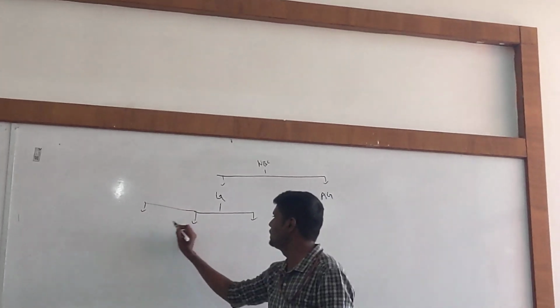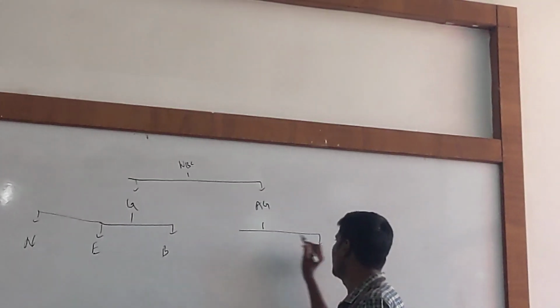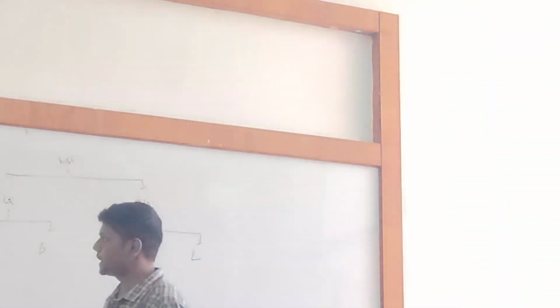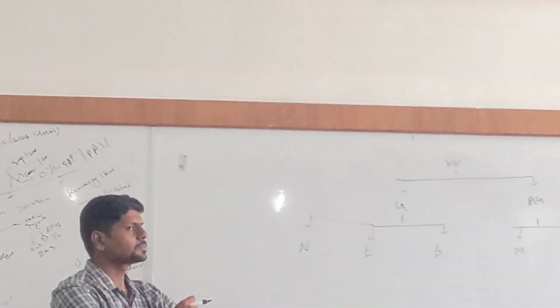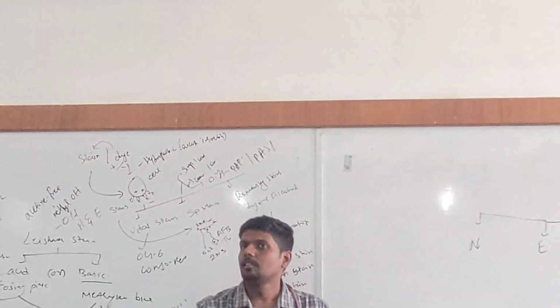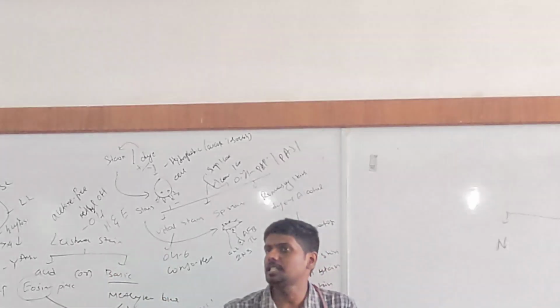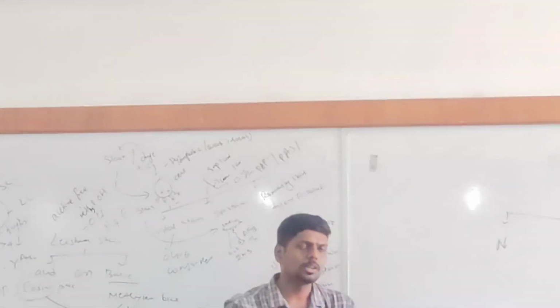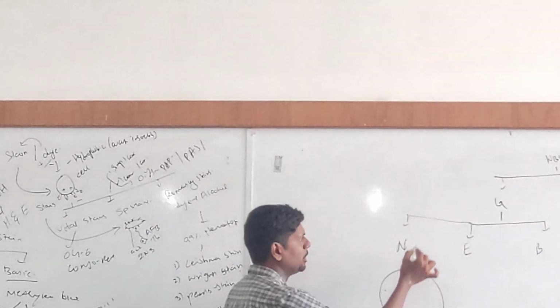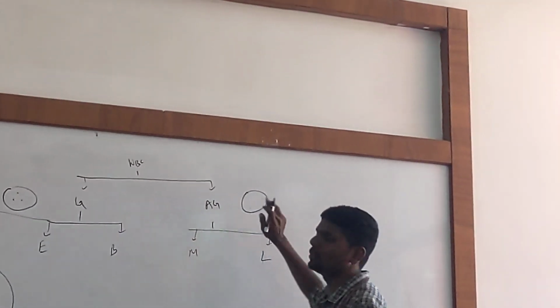What are the three granulocytes? Neutrophils, eosinophils and basophils. Then agranulocytes: monocytes and lymphocytes. Clear? Now listen. The naming of these cells has been derived by staining. When scientists started staining the white blood cells, they started naming the cells. Initially they saw some granules, so those are granulocytes, and agranulocytes have no granules.